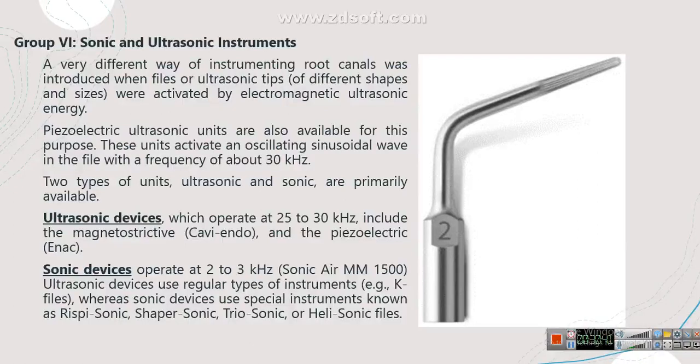Ultrasonic devices use regular types of instruments, for example K-files, whereas sonic devices use special instruments known as Rispi-sonic, Shaper-sonic, Trio-sonic, or Heli-sonic files.